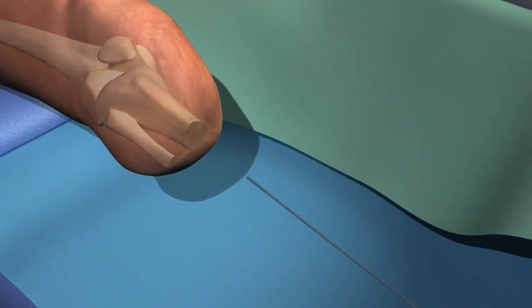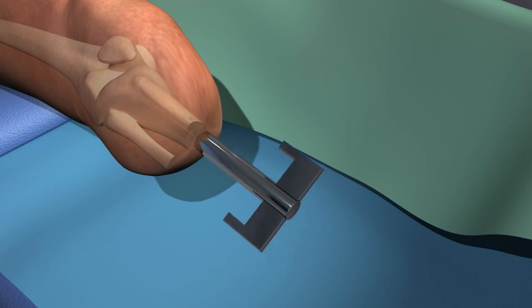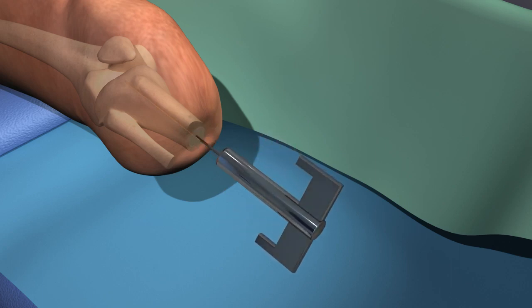The technique is done with an incision through the end of the leg, a stoma is created, and a wire is placed centrally in the bone.